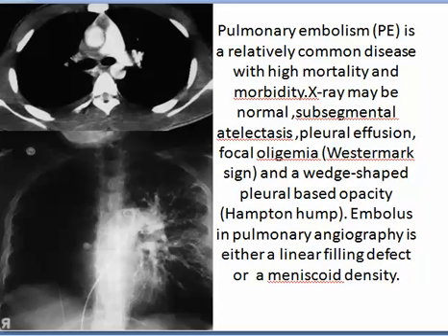So the signs of pulmonary embolism: maybe normal, subsegmental atelectasis, pleural reaction, focal oligemia, and wedge-shaped pleural-based opacity.